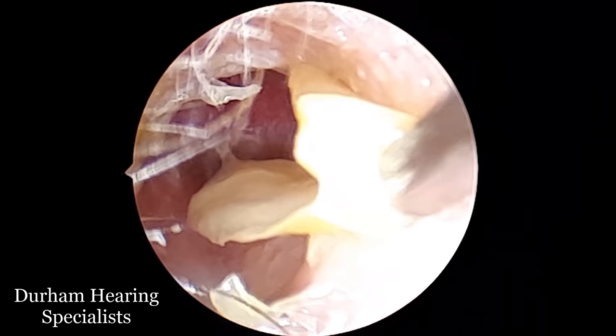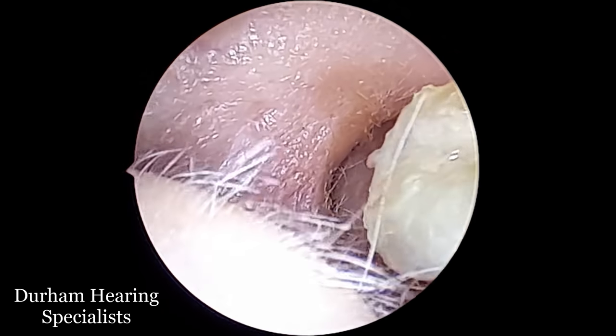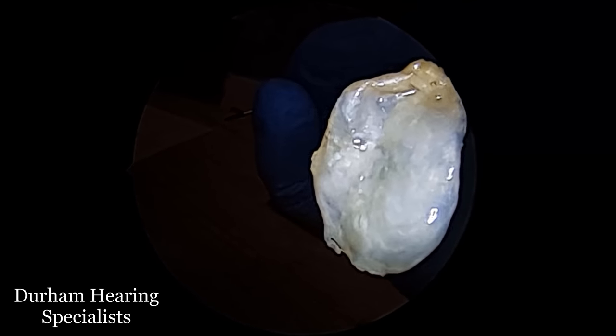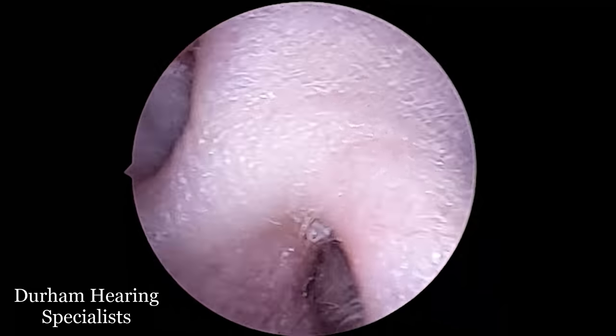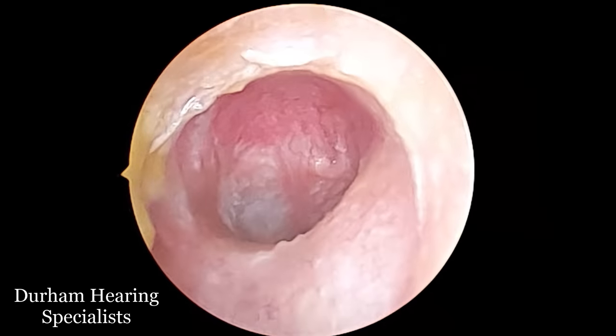And there we have it. What's very interesting is that this piece of skin is almost really a mirror image — sort of a ghost image of the eardrum. So it's the right shape and size, and it's got slightly concave in the middle. Then if we go back in, we'll see what is the true eardrum back there.